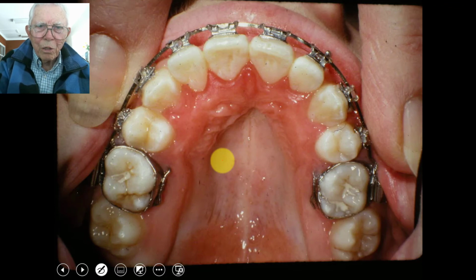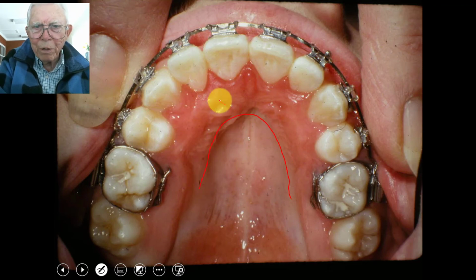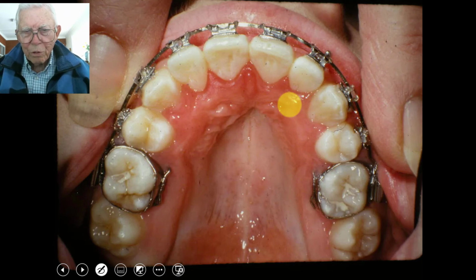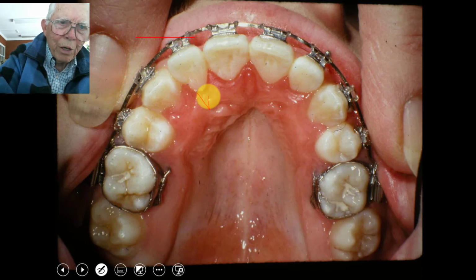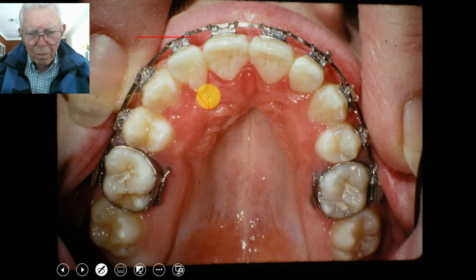And this was the lateral that had the palate. And the palate has begun to shape out a little better in there, but it's still got some fullness right in here. And you see this tooth, the lateral on the left side, is better shape. Hopefully we'll torque that in. We've got a good rectangular wire now up here, and we'll put torque in that to bring this root in and to bring that one out some and bring the crown in.